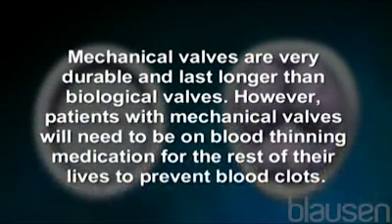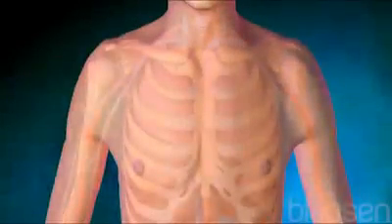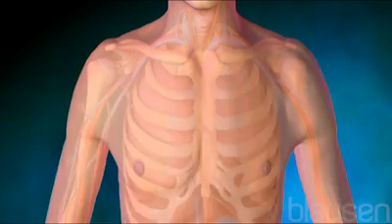Mechanical valves are very durable and last longer than biological valves. However, patients with mechanical valves will need to be on blood-thinning medication for the rest of their lives to prevent blood clots. Minimally invasive surgery is an option in some patients. The doctor may choose to access the heart through the ribs or a smaller incision in the upper chest. It reduces tissue damage and recovery time.